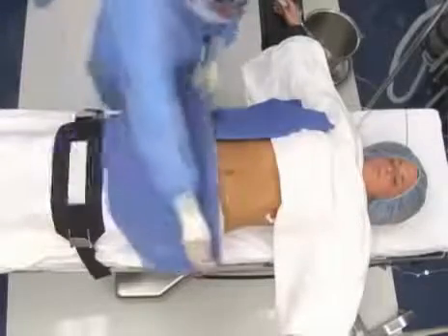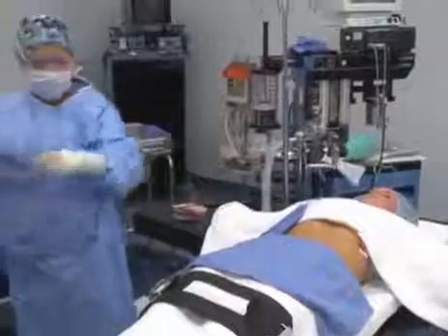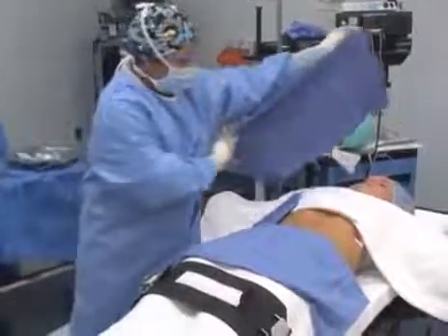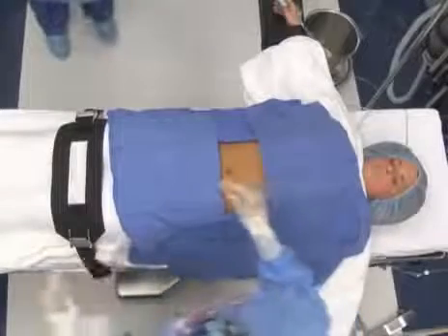Framing the incision means providing an opening in the drapes for the incision. The open area inside the frame is called the fenestration. The fenestration can be square, oblong, or oval if a disposable fenestrated drape is used. The plastic incise drape is commonly placed over the entire surgical site on top of the towels and any bottom sheets and towels which form the fenestration or opening for the incision.